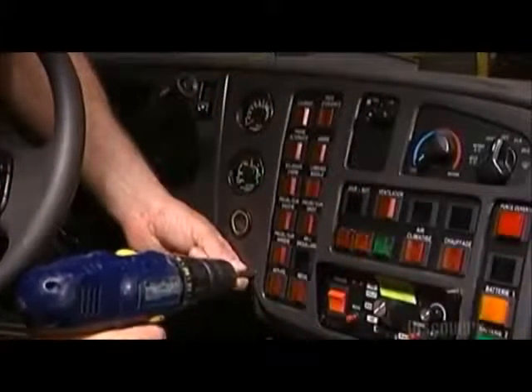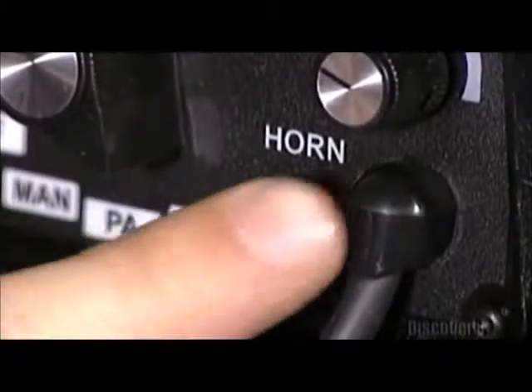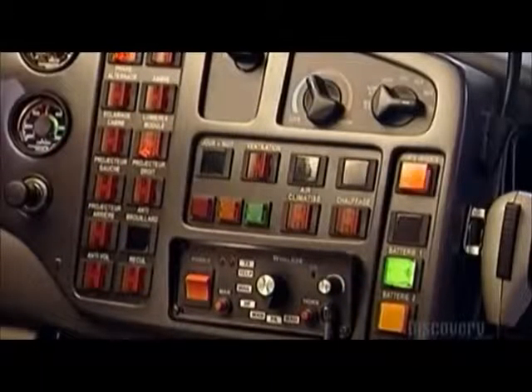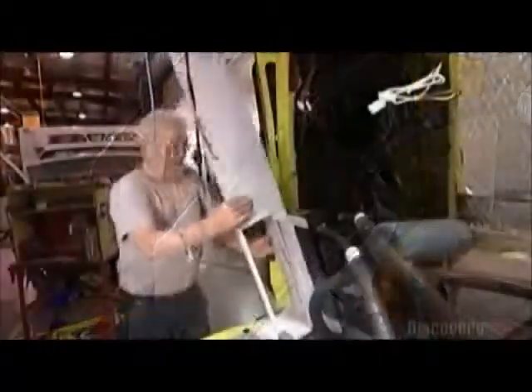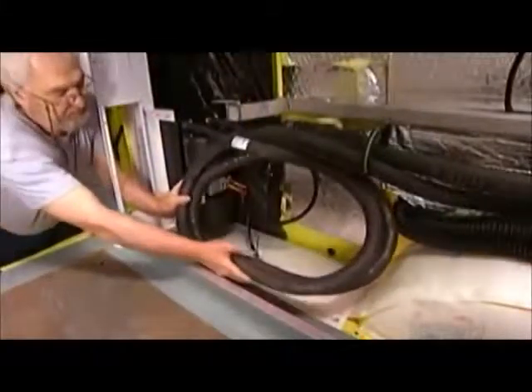Once assembled, the console goes into the dash and workers test everything out. The heating and air conditioning systems in the original truck aren't strong enough, so the ambulance factory adds an extra system of each to work in tandem with the existing systems.